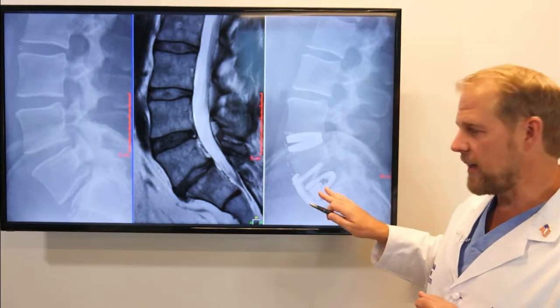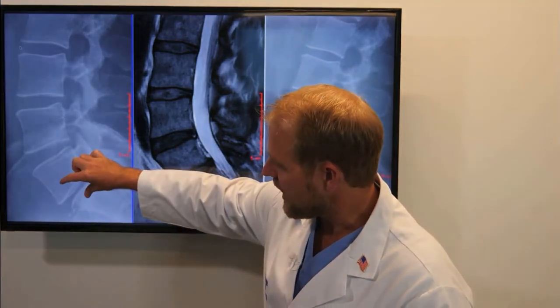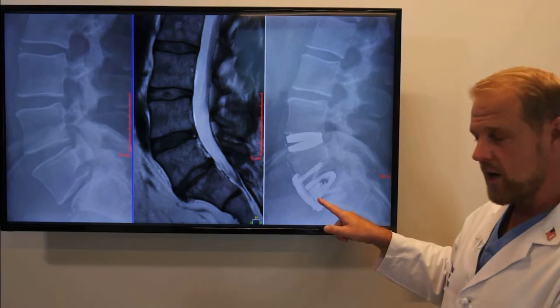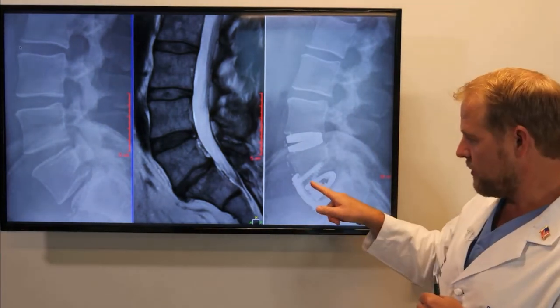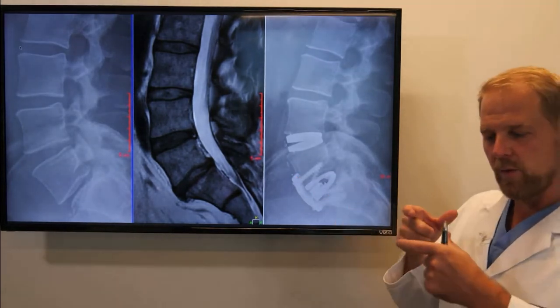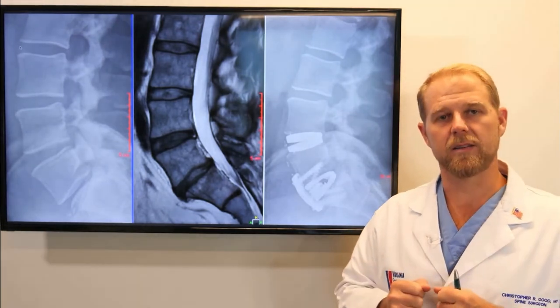Now at the L5-S1 level, that disc has been removed, and we can see we've distracted those bones apart and put in an implant. This is a cage that goes in like a shim with bone graft and a plate on the front, welding these bones together. When people have instability between their bones, there are times when the fusion is the best option.